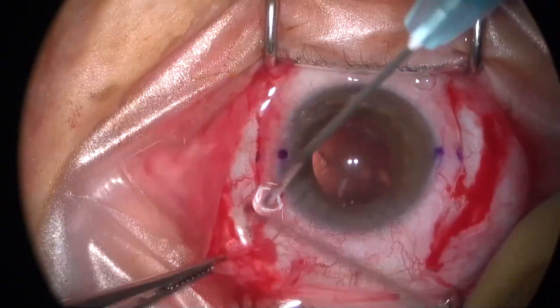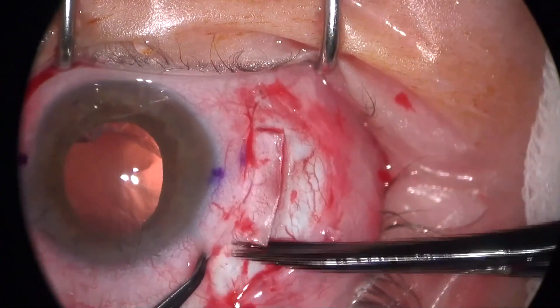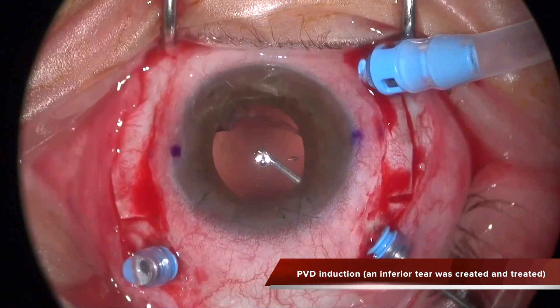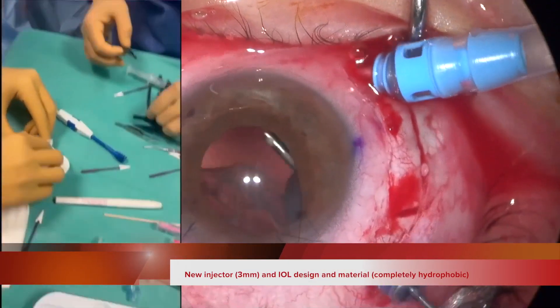This is the new Soleco Tau scleral fixated IOL. This is the hydrophobic version of the Soleco Fill SSF. The technique for the implantation of the lens is exactly the same and you can see the new IOL injector and the new IOL design.